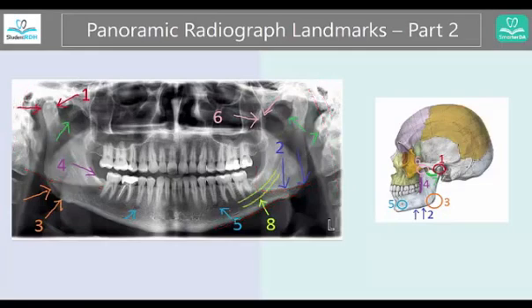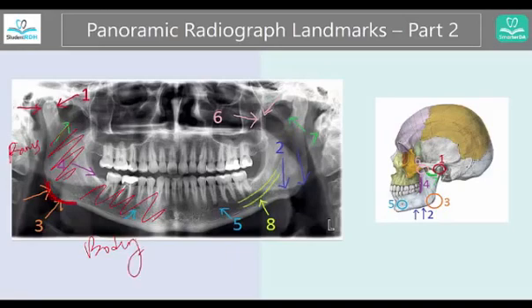Number three, we have this area — this is the angle of the mandible. The vertical part is called the ramus and the horizontal part is called the body. This part that joins them together is simply called the angle, and you can see number three over here.